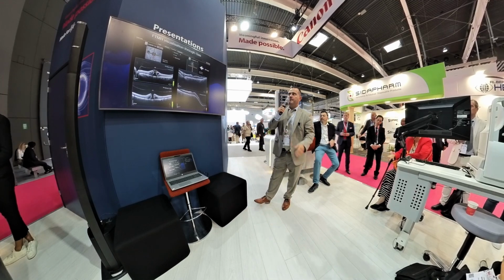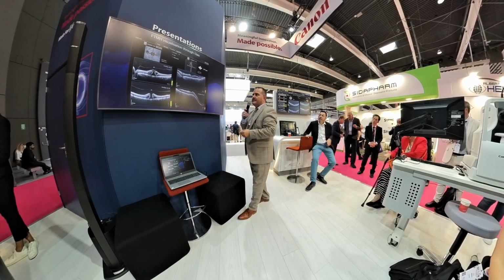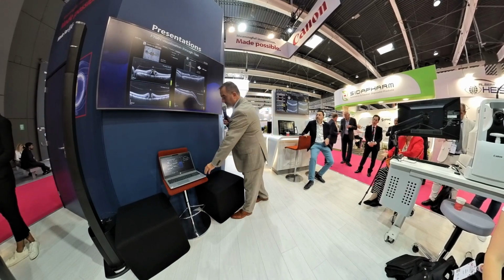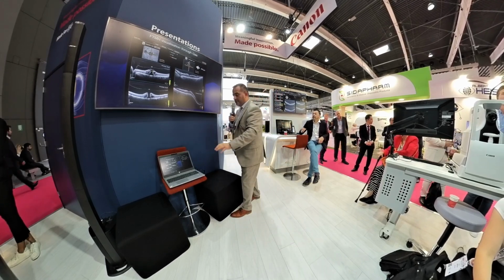Another case of full thickness macular hole, again imaging through gas. As I said, really important and really useful for the patients and for us also actually to adjust our surgical technique, if we need to, as soon as possible.